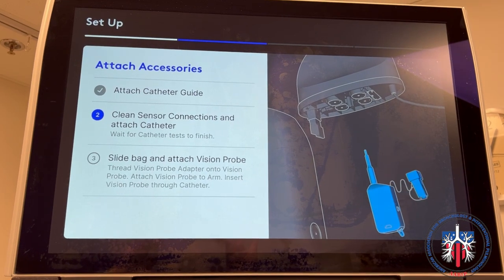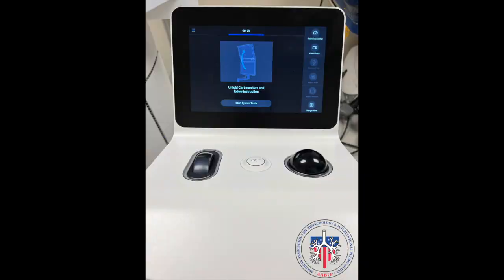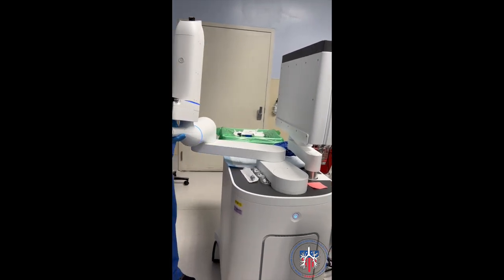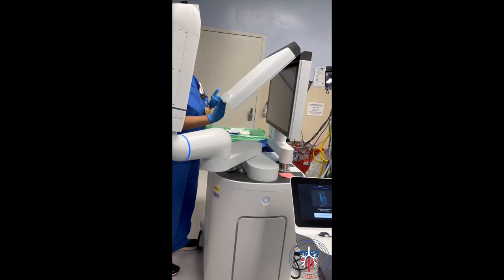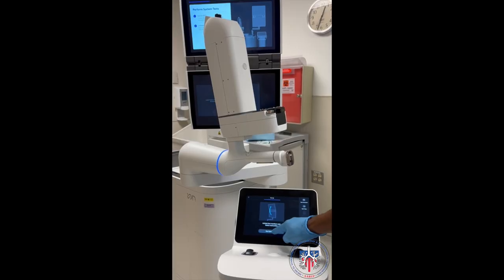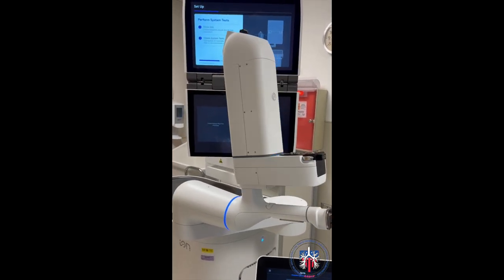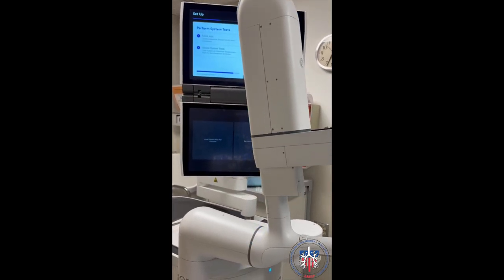Guided setup instructions are provided on the monitors on the ion system and the controller unit. The first step for system setup is provided on the controller unit. The robotic system arm is moved away from the monitors to unfold the double screens. Use the touch screen to initiate system tests on the controller unit. Ensure that there is space for the robotic arm movements during calibration.